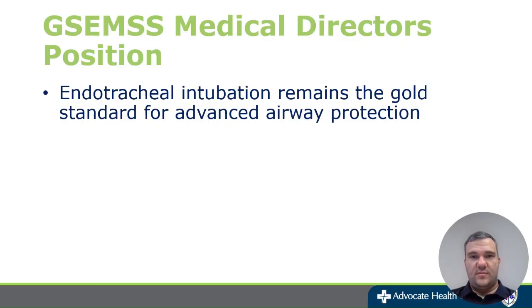So within our system, our current position on ET tubes and airway management is that endotracheal intubation is the gold standard, and this is because it does protect against that aspiration risk, which is associated with worse outcomes for the patients, and infection and things along those lines. There are other areas in our system that are using an I-gel as first line in cardiac arrest patients. At this time, we are not going to go that route. We will continue with endotracheal intubation as our gold standard or first line in those type of situations.